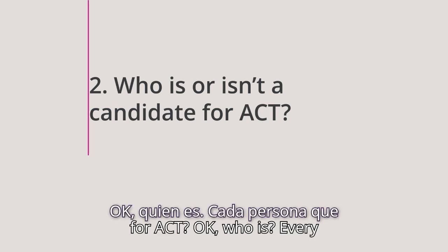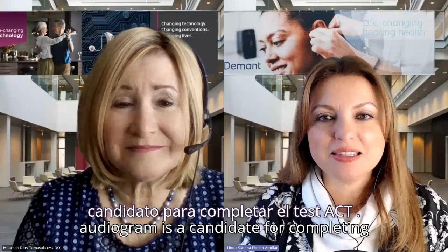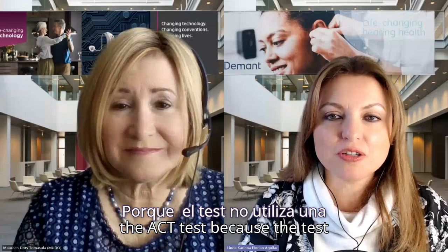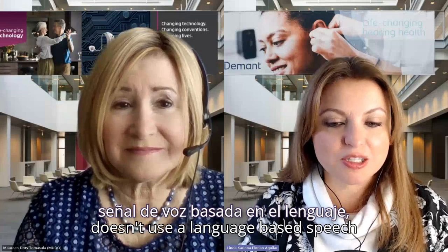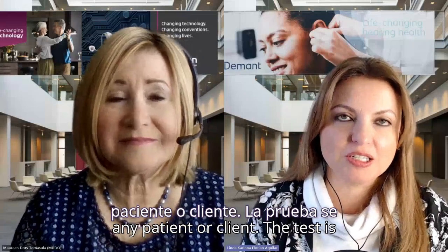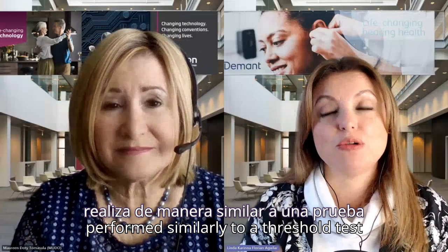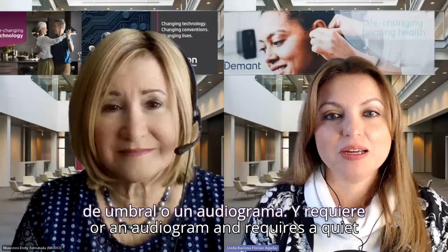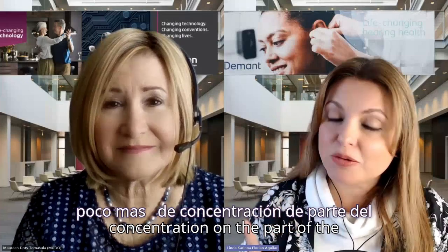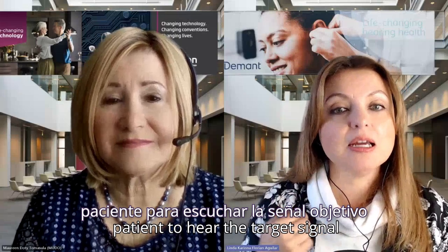Okay, who is? Every person who can participate in an audiogram is a candidate for completing the ACT test because the test doesn't use a language-based speech signal. It can be used with almost any patient or client. The test is performed similarly to a threshold test or an audiogram and requires a quiet space. It does take a little more concentration on the part of the patient to hear the target signal compared to the background signal.